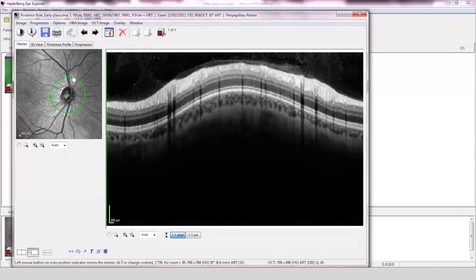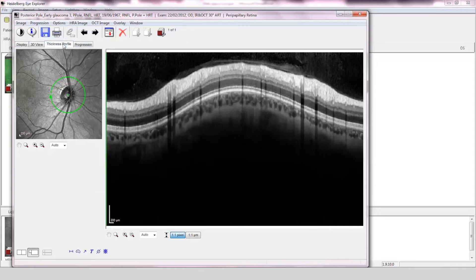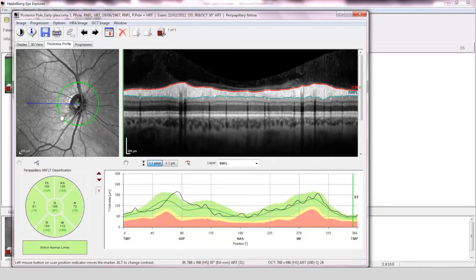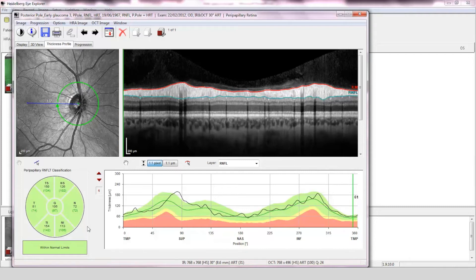Assessment of the retinal nerve fiber layer. The OCT scan is of good quality and is centered on the optic disc. The fovea-to-disc alignment is correct and the retinal nerve fiber layer has been accurately segmented. The comparison of the scan to the normative data is within normal limits and the retinal nerve fiber layer profile has a double hump configuration.